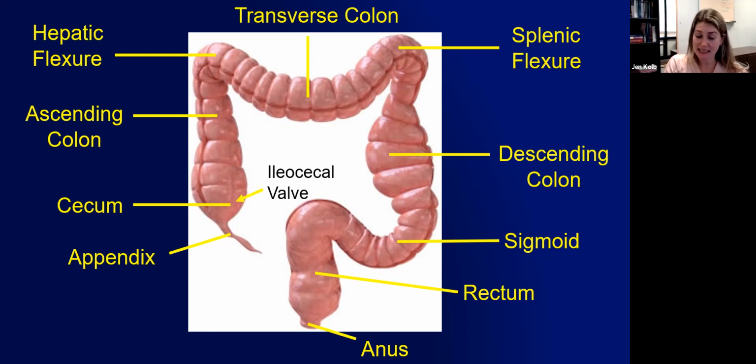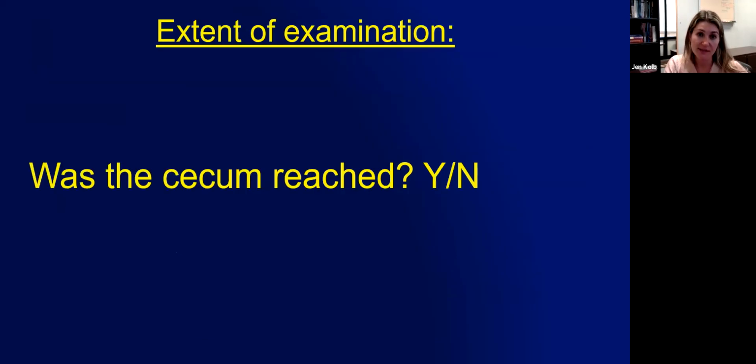And then the cecum, the thing that you see from the cecum, if you wanted to keep going, you'd have to go through the ileocecal valve. So the most important question is, was the cecum reached? Yes or no? And this is whether or not the procedure was complete.